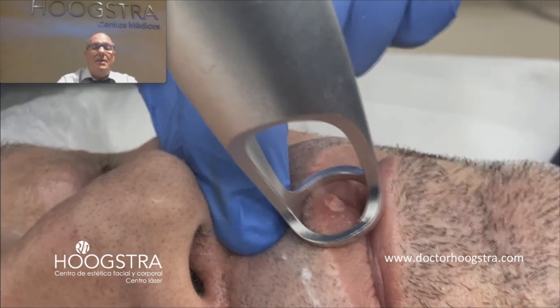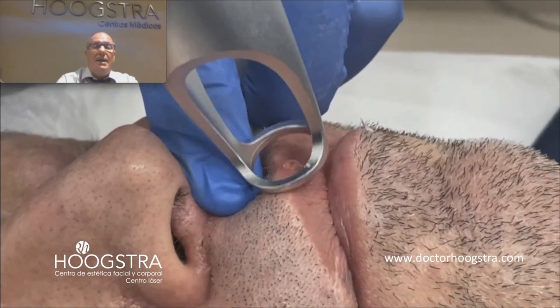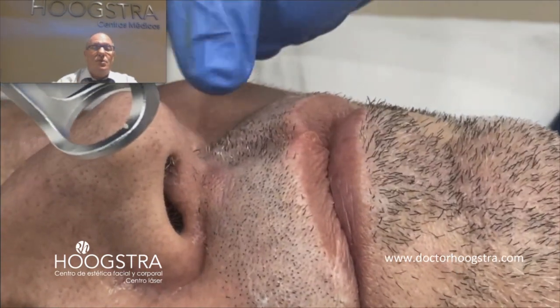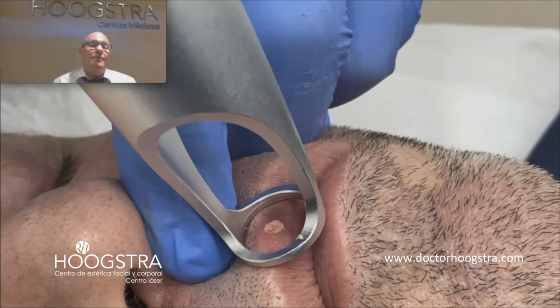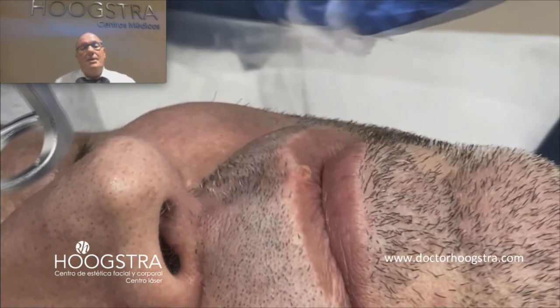Here we can see with the Lotus laser how I produce ablation of the tumor, the scar, and with this zoom piece I produce evaporation of the superficial layer until I get to the surface of the skin.